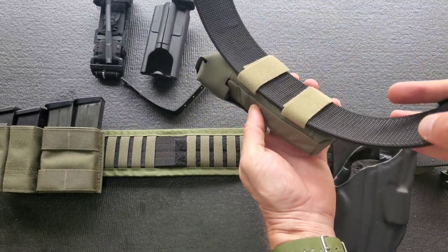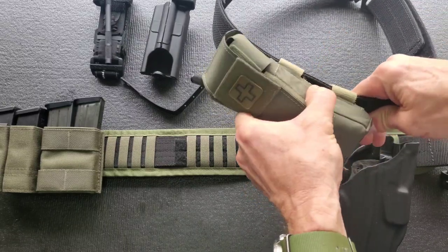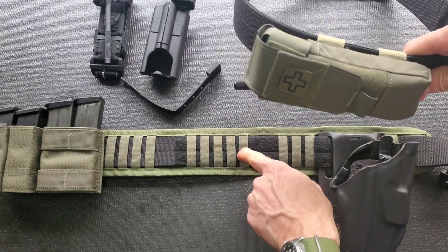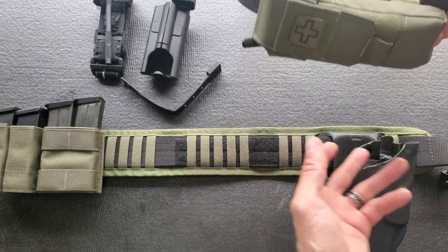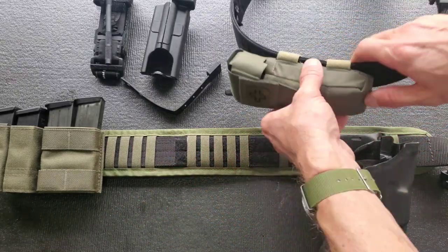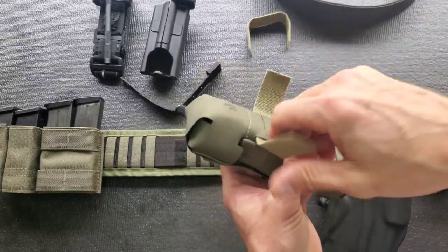You just wrap it on like that and it's not going anywhere — that is a good secure mounting method, no wiggle. That is ultimately how I'll configure this belt, but for right now I would have to undo all of this, so for brevity's sake I'm rolling with the two inch Uncle Mike's for display here.